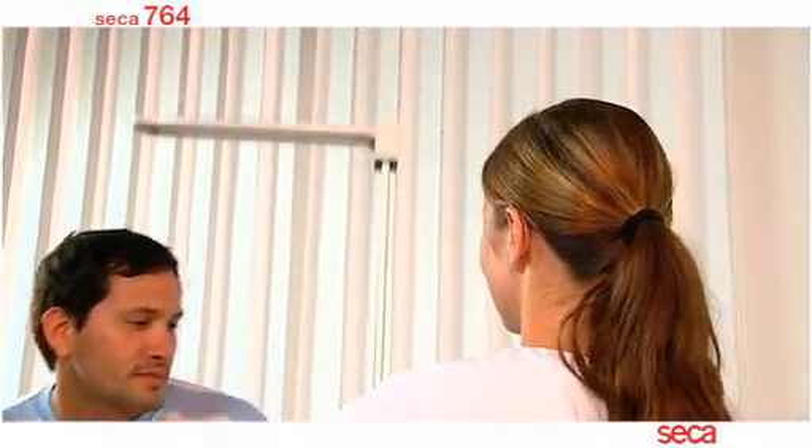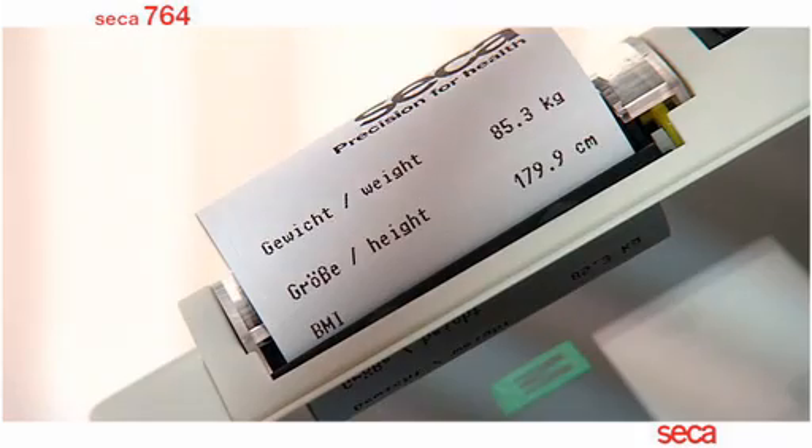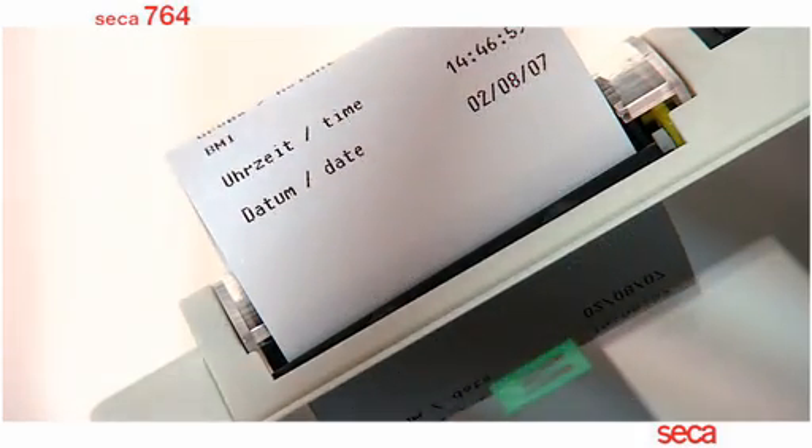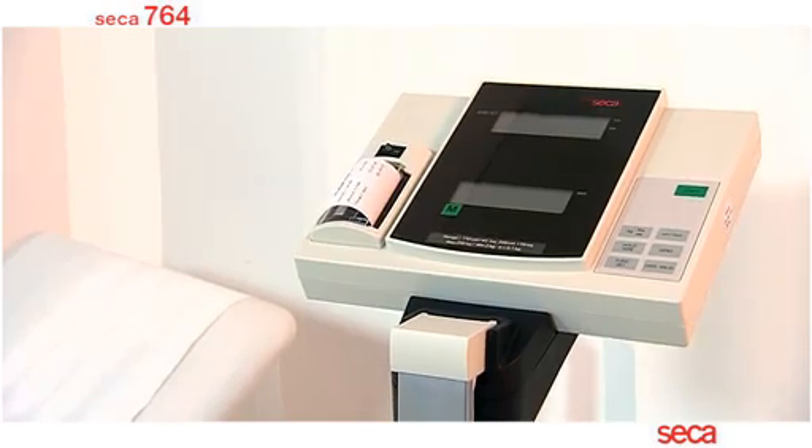When finished, the patient can leave the scale, which in turn will activate the printer and produce a complete printout of the patient's data, including weight, height and body mass index.